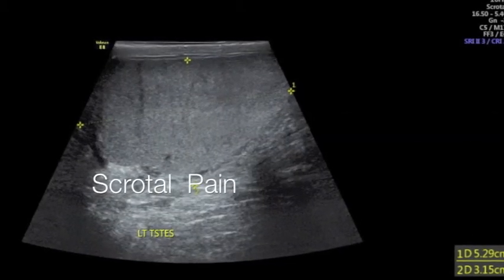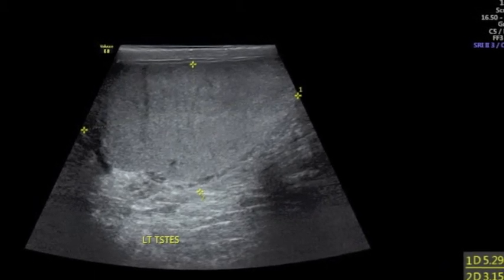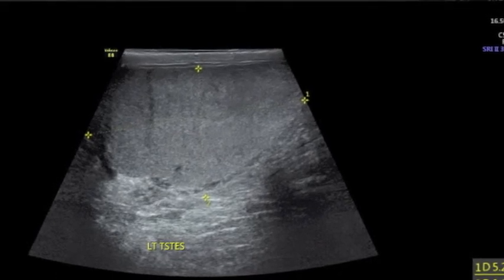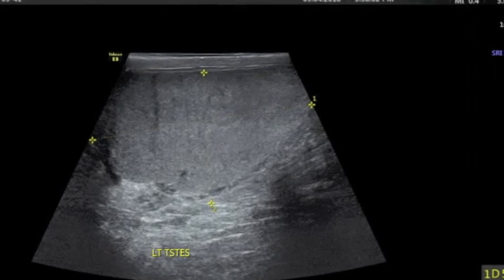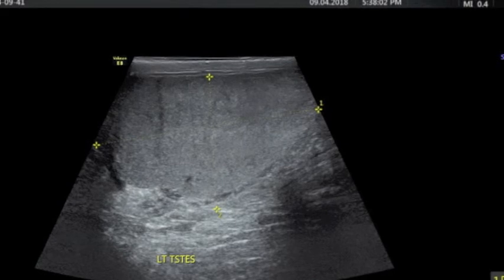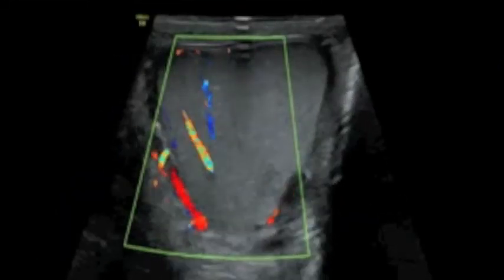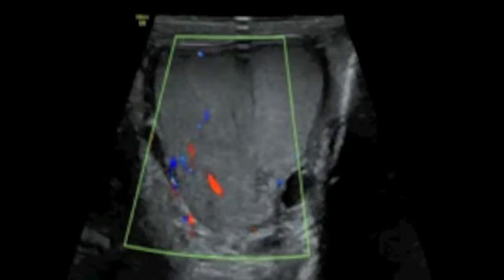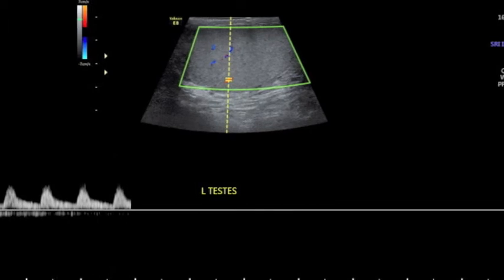Once we encounter a patient, a quick, nice way to start the scan is to do the normal side first. We have a patient here with right-sided scrotal pain, and what we are doing now is actually viewing the left testes. We put the color box on and note nice vascularity, both arterial and venous, and grab the spectral waveform of the artery running through the testes to confirm absolutely normal intratesticular flow.